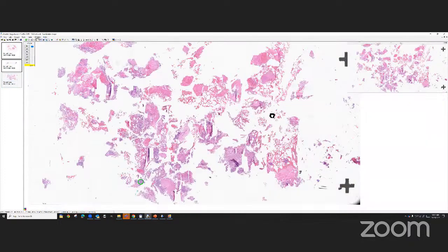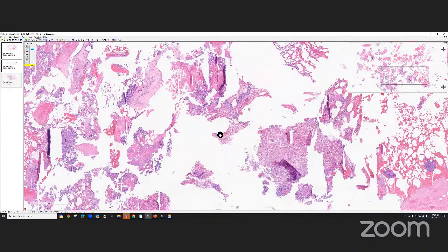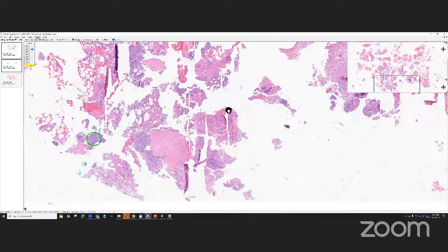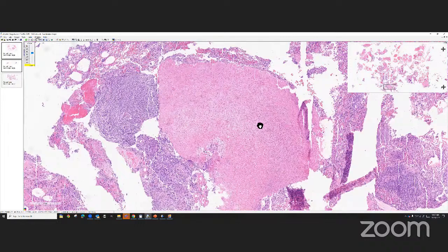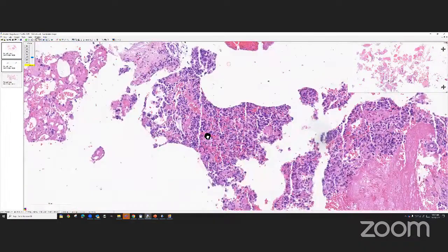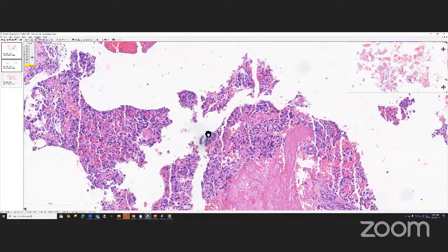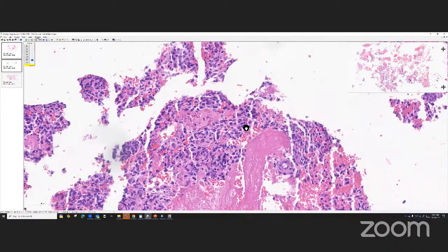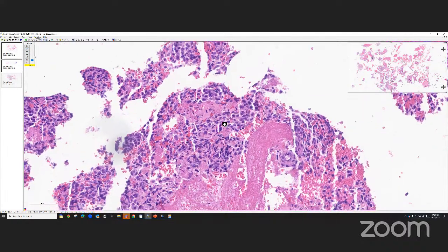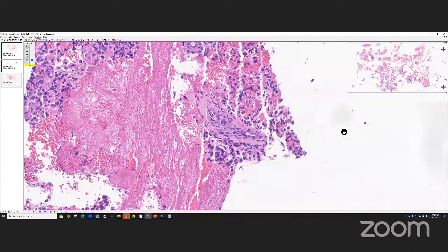And then we look at our biopsy specimen, okay? And so we've got lots of fragments. There's a little bit of fibrous tissue, and then we see these kind of large collections of tumor. We don't have much stroma here, so that doesn't really help us to get the interface with the stroma, but it does give us a sense of how to look at the individual tumor cells. And we can see they're kind of round oval, irregular nuclei, okay, and some of them have eosinophilic cytoplasm. So it's not such a total small round blue cell tumor because they do have some cytoplasm, okay? Some of them are a little bit fusiform, maybe even a little bit spindly.